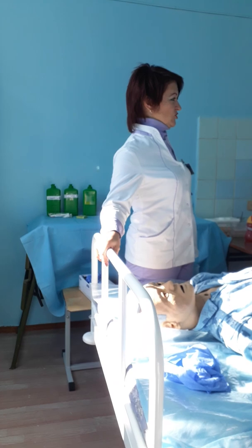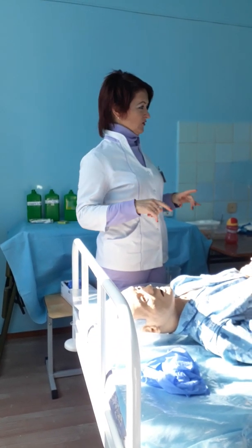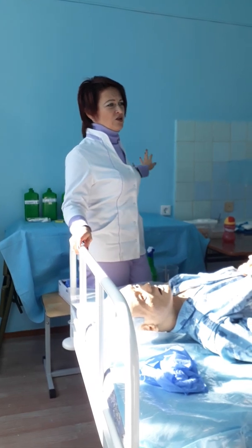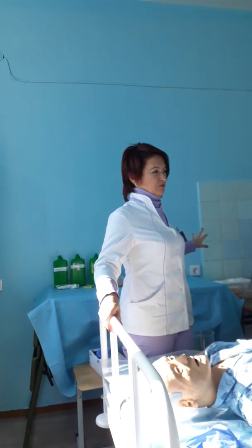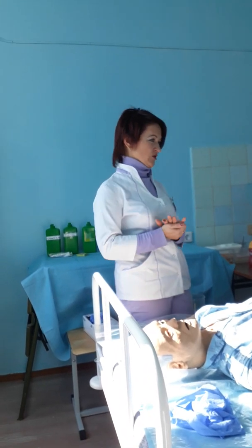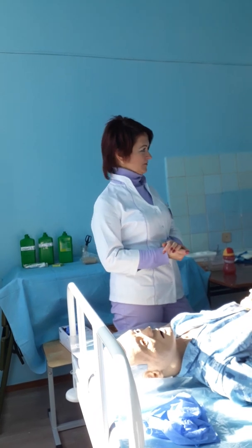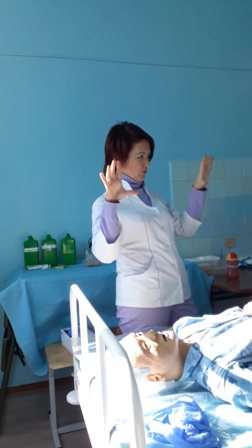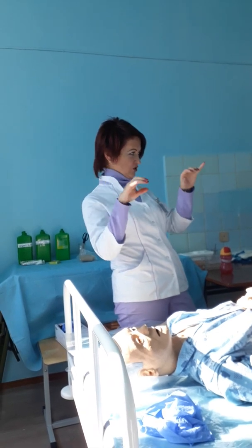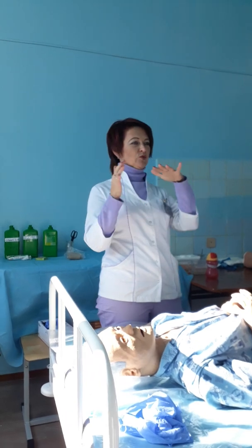First step when you start your injection practice: you must clean your hands. Then the prescription list. What information can you read? Name of patient, age of patient, allergies, and the dosage information about the patient. Medicine is the first part, and the second part is information about the manipulation.